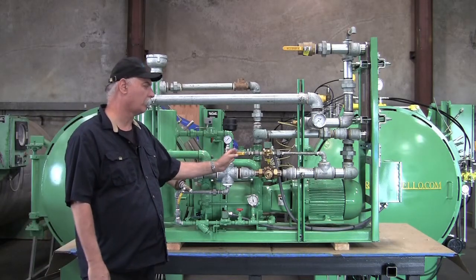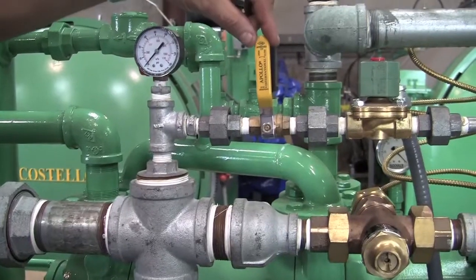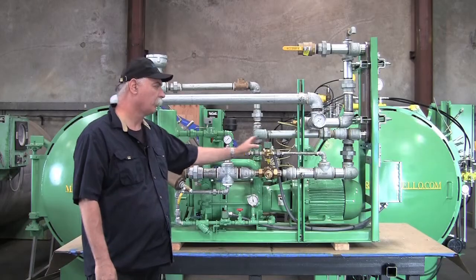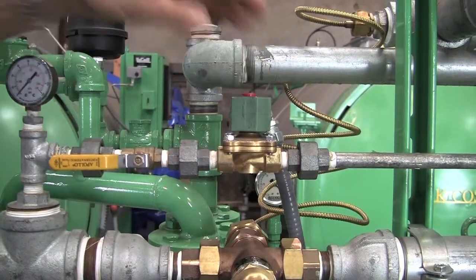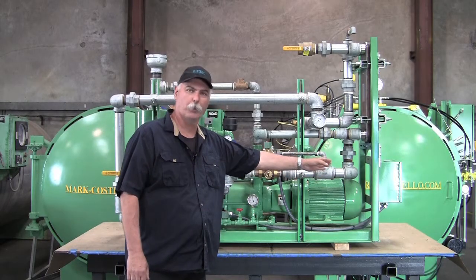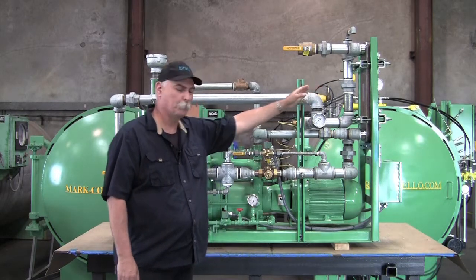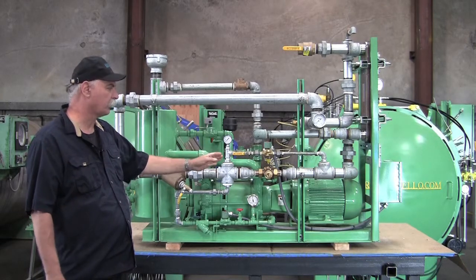From the cross, it will also come up to a ball valve, which you want to remain open — it must stay in the open position. You have a solenoid. When your vacuum system starts, power will be given to this solenoid, thus allowing water to go through your system, bypassing it, to make sure your condensate cooler is filled up. You want to have that full of water before you start pulling hot steam and condensate through it.